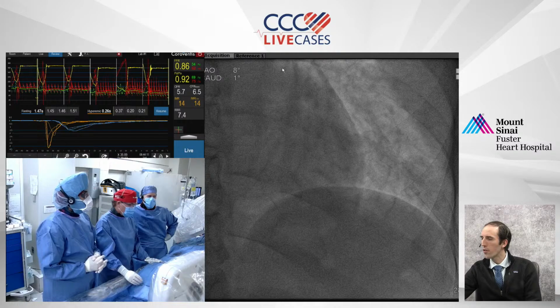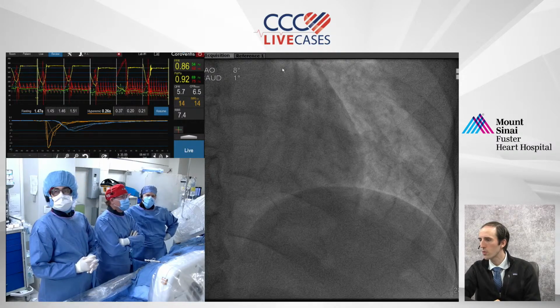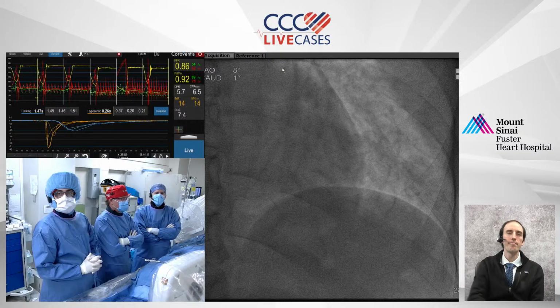I don't either. Well, there were some questions in the chat. I'm just going to pose those to you guys. So the first question is, what are the absolute contraindications to this kind of testing? And I guess in that vein, maybe who should get testing as well?